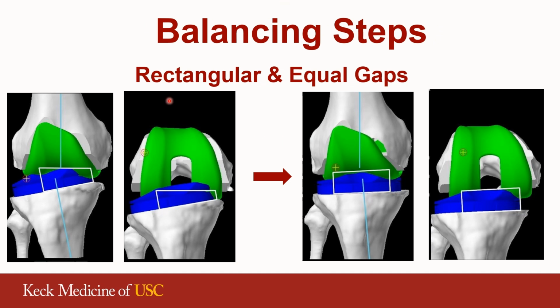The big breakthrough in robotic knee replacement is that it allowed us to make small adjustments with precision that are specific to the patient's anatomy, so that rather than having to place every patient at 0 degrees mechanical varus of the tibia and 5 degrees of anatomic alignment in the femur, we could make small adjustments based on the patient's anatomy. So all varus knees start out with this trapezoidal gap, where we're larger on the lateral side, smaller on the medial, both in extension and in flexion.